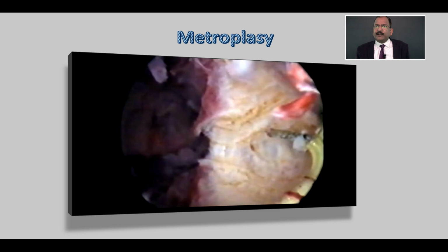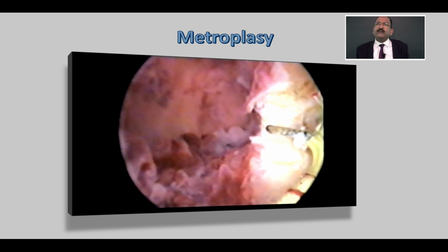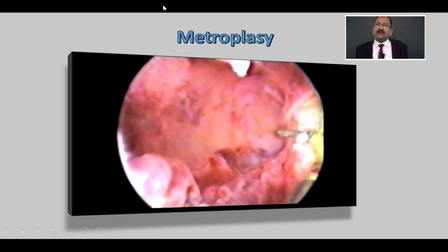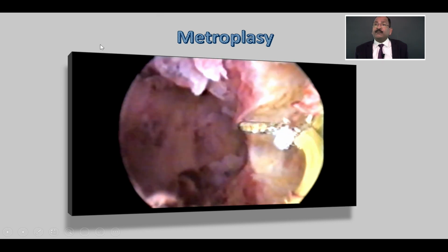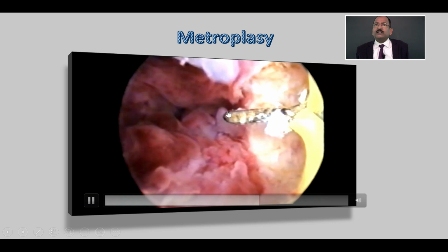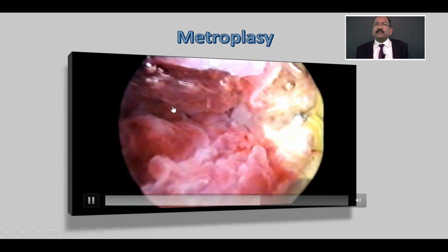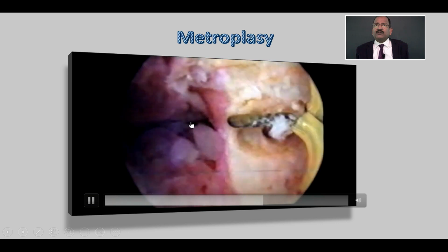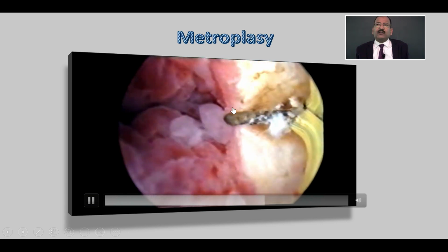And millimeter by millimeter, don't move much. Slowly you will cut because you are going proximal to distal. Again here you will wait and check the surrounding texture, and once you start seeing it is equal, then stop.